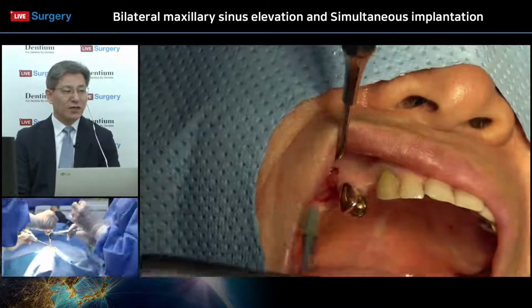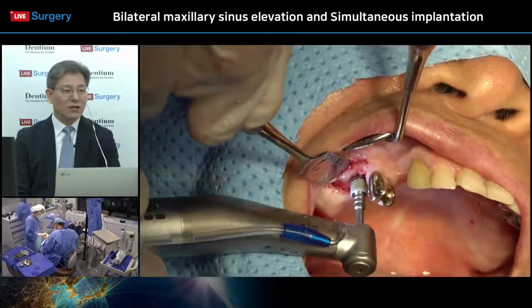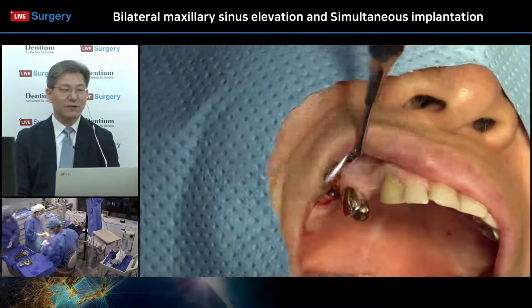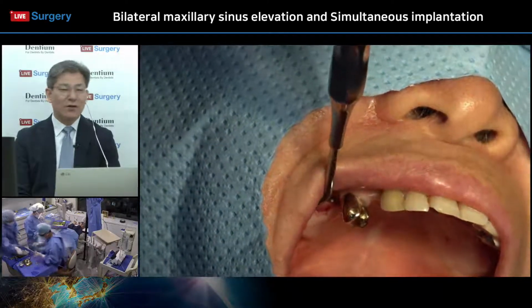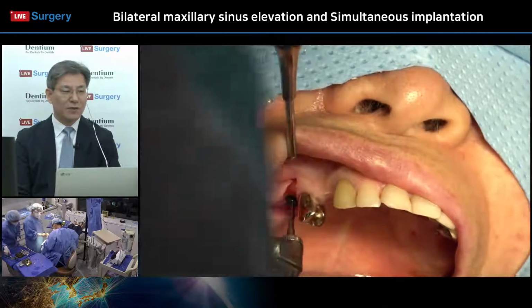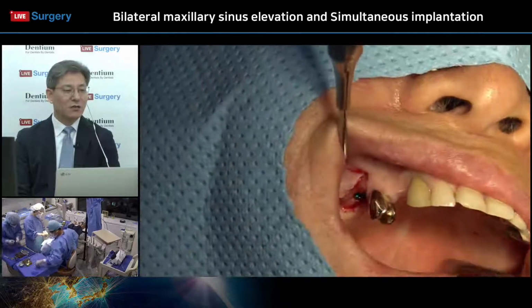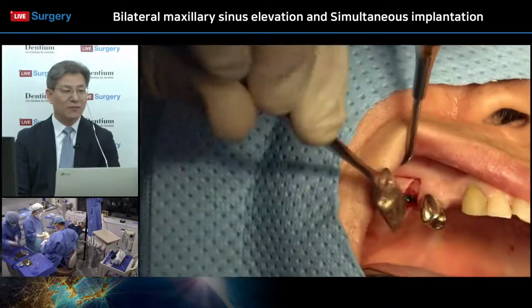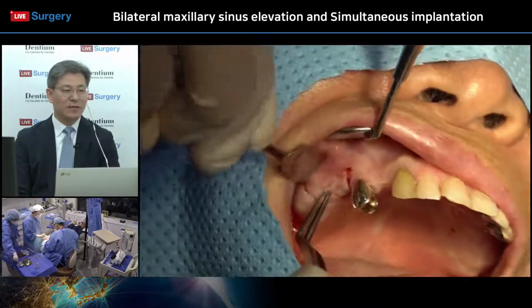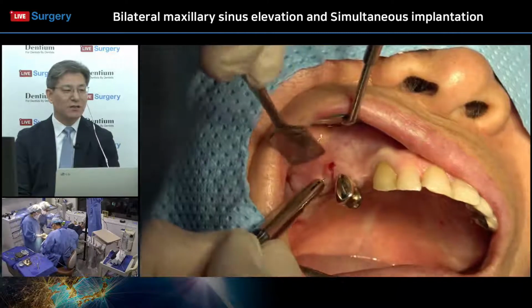For the ordinary drilling sequence, I strongly recommend that underside drilling is better than the regular drilling procedure. So if you want a 5.0 diameter, 4.5, or in some cases 4.0 drilling is enough for 5.0. It means smaller drilling relative to the expected implant diameter gives us a higher insertion torque in the implant placed area. Okay. Right? So, already done with this number 16 area.